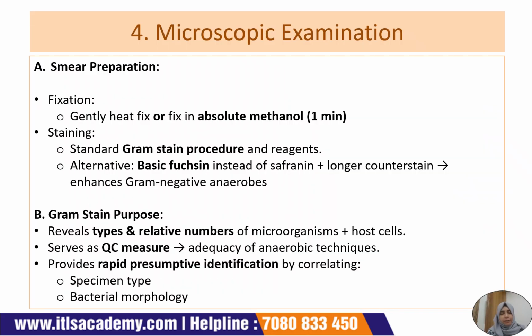Now that we have learned about specimen types, acceptable and non-acceptable specimens, the transportation devices, systems, and transportation methods, and the processing of the specimens, we will learn about microscopic examination. For microscopic examination, first we have to prepare the smear. For the smear, we first fix it gently via heat or in absolute methanol for at least 1 minute. For staining, we use the standard gram stain procedure and reagents.